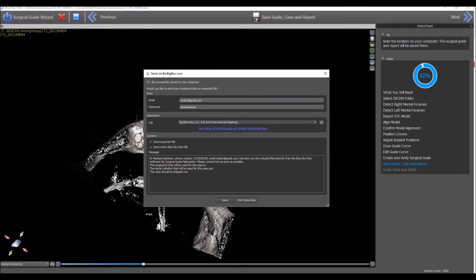The message field is pre-populated with some information that the lab would want to receive, such as your contact information and your email address.